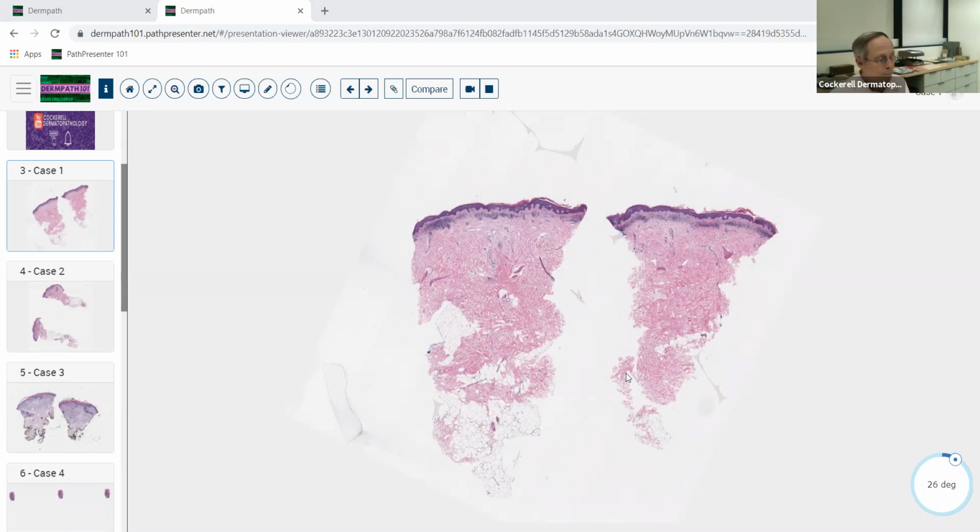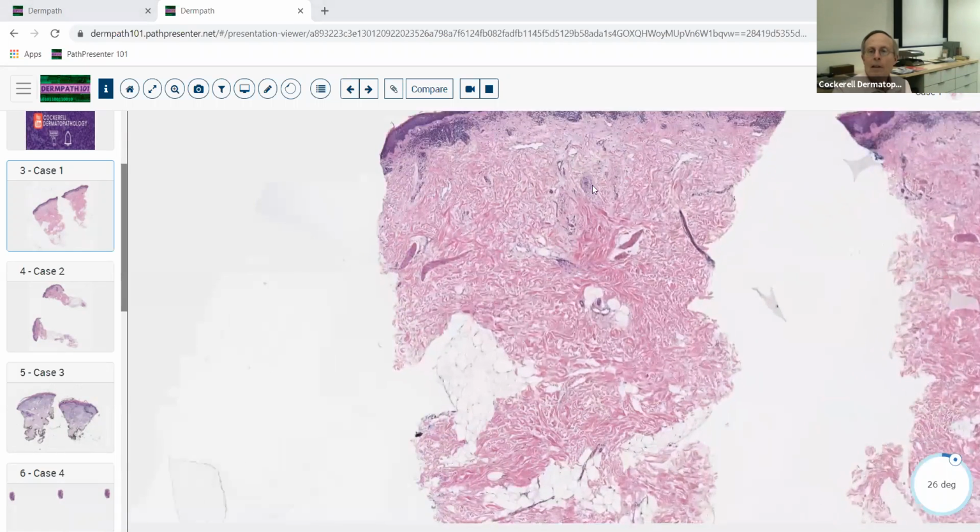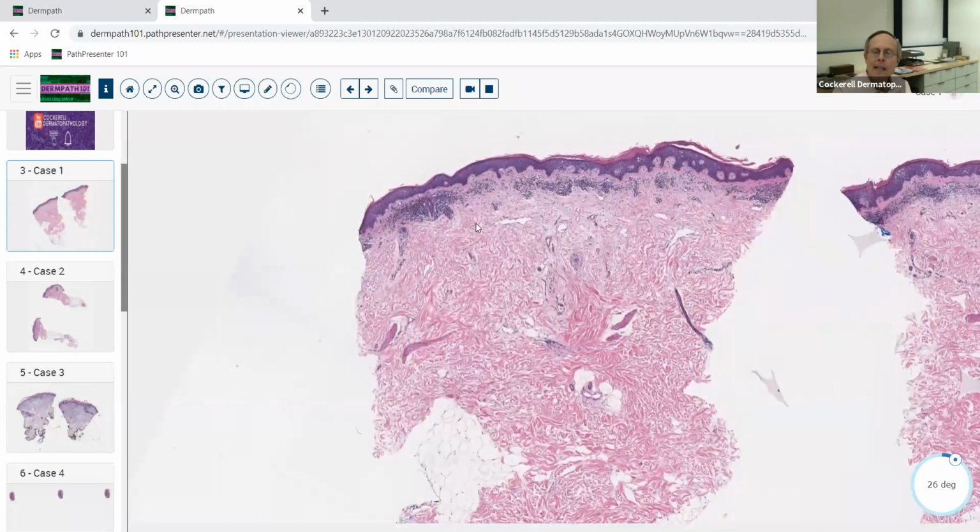So we're going to hit on things that can affect the DE junction this morning, mostly with vacuolar alteration, or they just kind of obscure it, but it's not really classically lichenoid. So this first case shows a superficial perivascular patchy band-like infiltrate of cells. These are lymphocytes here. You can see at low magnification that they are dark and black. And whenever we see that, think lymphocytes.